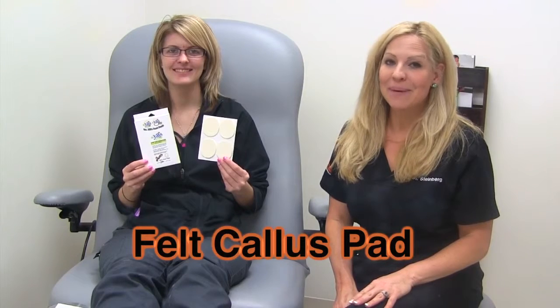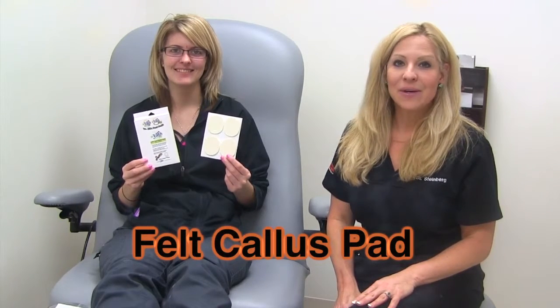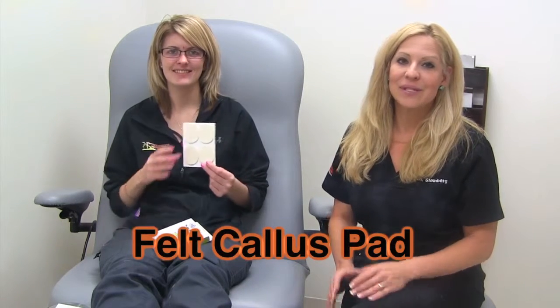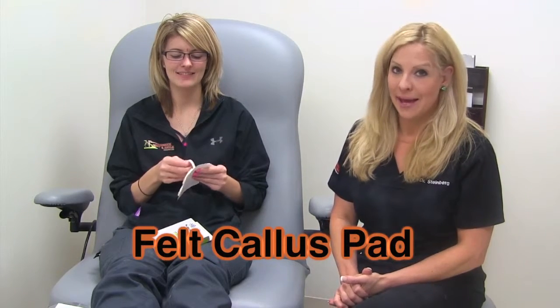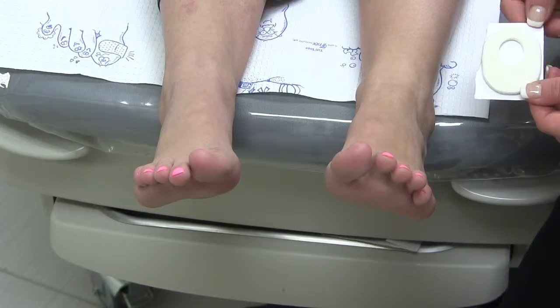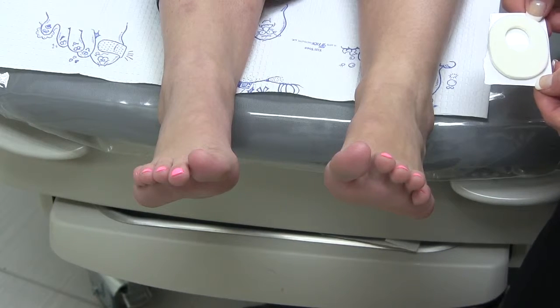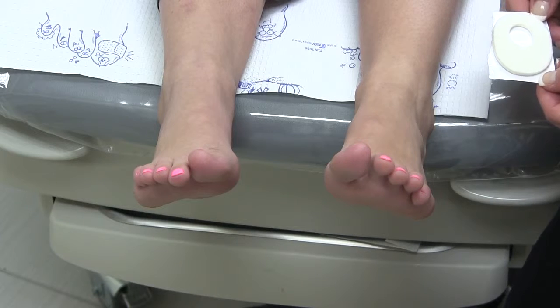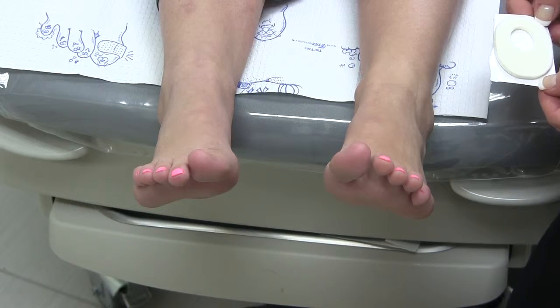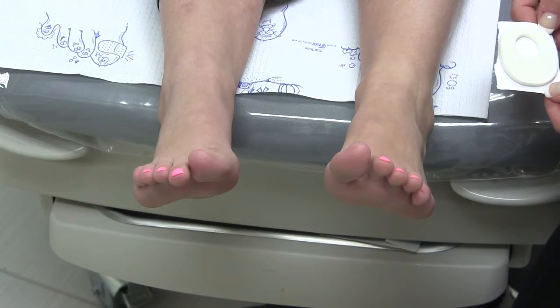This is the felt callus pad made by Dr. Jules. The center hole surrounds the sore callus and reduces pain by transferring pressure from the callus to the actual pad. This felt callus pad is exactly the same shape and size as the gel callus pad, and they do the same thing, except the gel callus pad is removable and reusable.